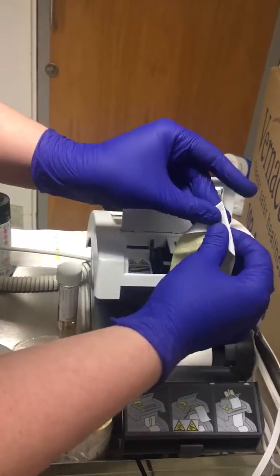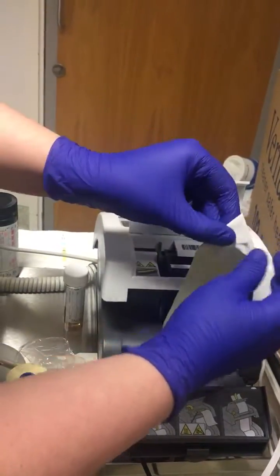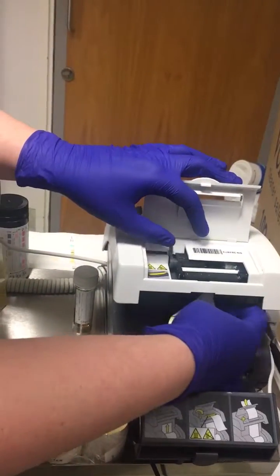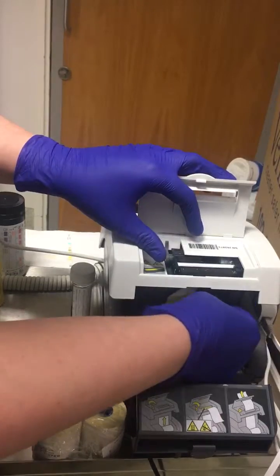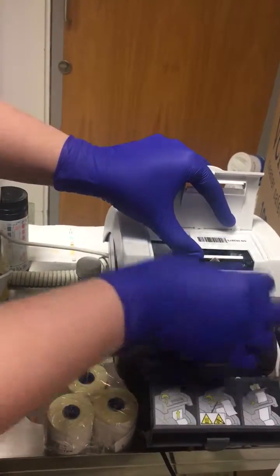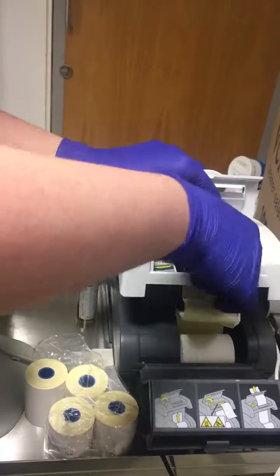Make sure that lever is released, and then you feed it up under here. Once you're able to grab the point, you're fine.